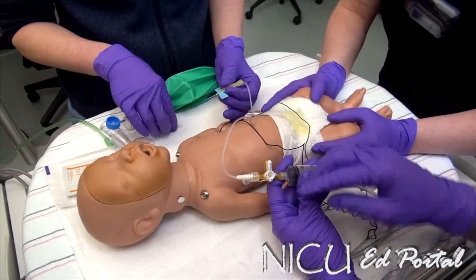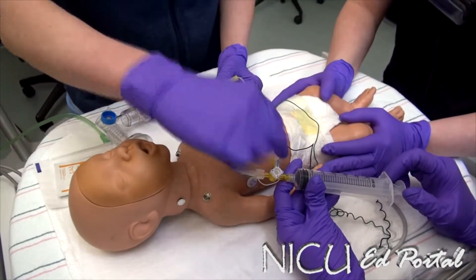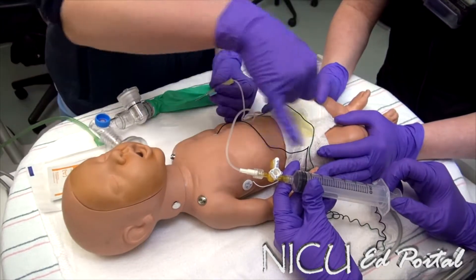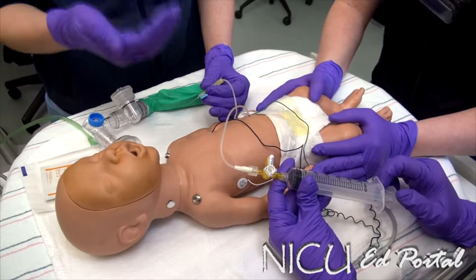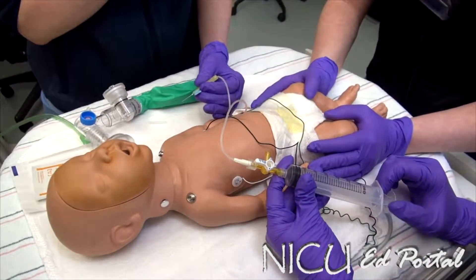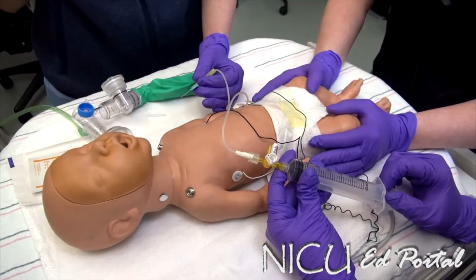Before pulling the air out, make sure you know which way the stopcock should be facing. When you pull air off, have the stopcock off to here so the air flows through the butterfly and through the syringe. To empty the air, turn the stopcock off to the butterfly and push the air out through the side port. Then turn the stopcock back off to the side port to pull more air.